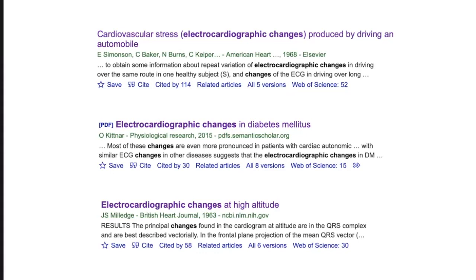the topic that's related to something we do a lot of is called uniqueness. That's a mathematical concept, actually, with a mathematical definition. What it practically means is that just about every little change in the heart of any significance will change the ECG in some direct way. If this part of the heart tissue is inactivated, like a bundle branch, or even some smaller part of tissue, that will cause some change in the ECG. And you can even map out that relationship.